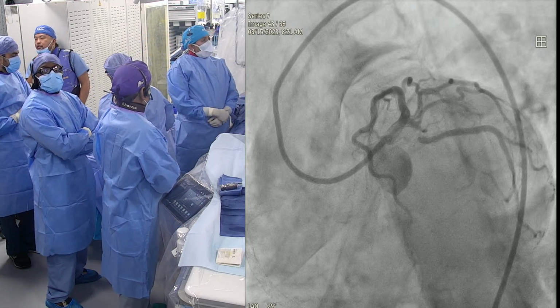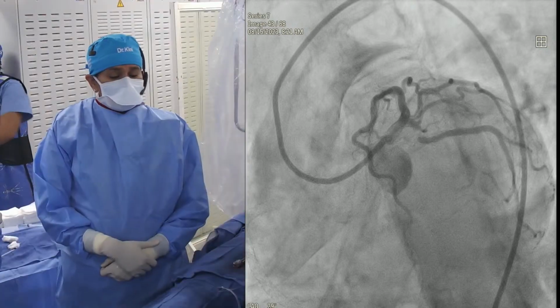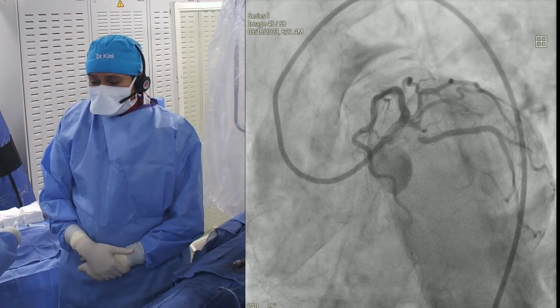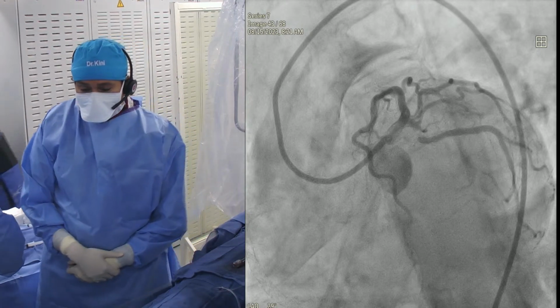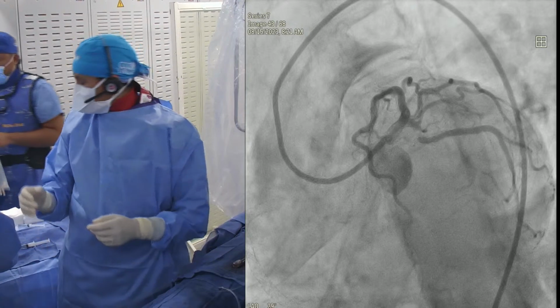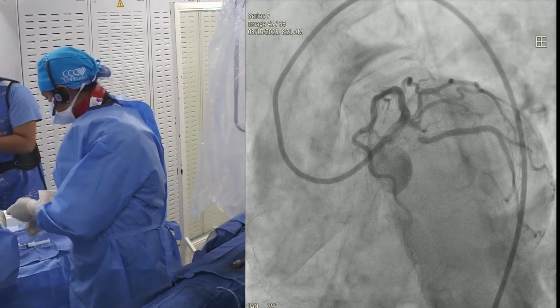You are going to go with a strategy and which balloon wire. So we will do Fielder fine cross and then change to, I think we just have to do rota floppy, not a stiff wire here. It will be a lot of wire bias otherwise. And then 1.25 burr. Yeah. Open the 1.25 burr. You know what? Don't open yet.